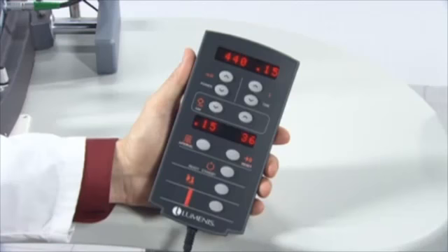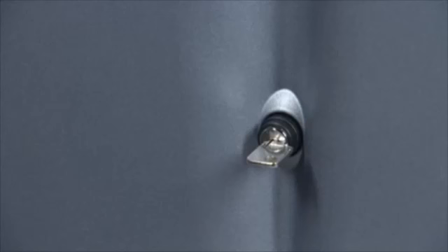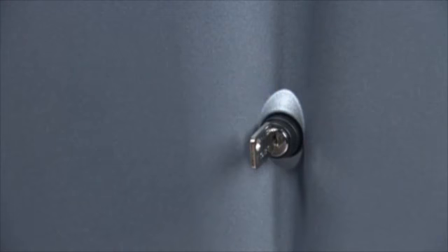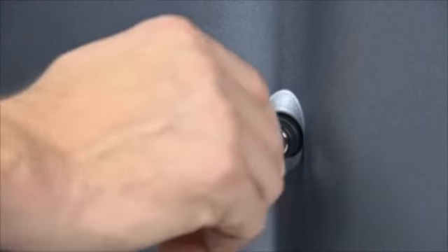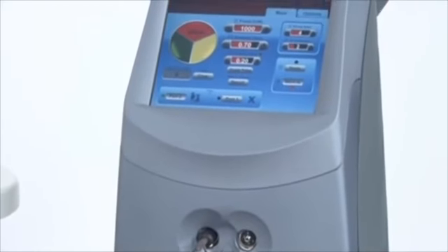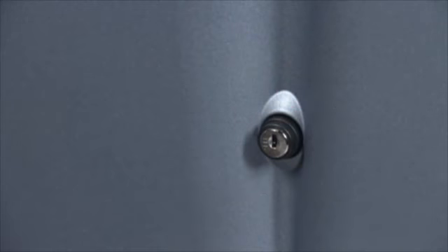When the remote control is connected to the laser, the ready standby selector illuminates to provide an additional visual warning that laser energy is accessible. If the laser needs to be restarted after troubleshooting or addressing loose connections, etc., turn the key switch to the off position and wait 5 seconds, then turn the key to the on position. To turn off the laser under normal operating conditions, simply turn the key switch to the off position. Remove the key to prevent unauthorized use of the laser.